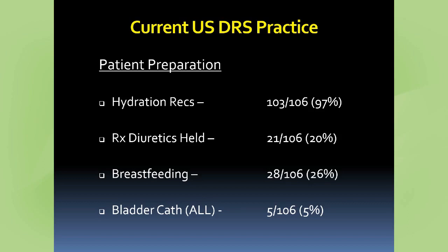And that used to be the standard of care. But now it's really, like I mentioned, very young patients, neonates who can't void spontaneously, we catheterize them. Anybody else with difficulty voiding. And then the other time we consider it is if it's specifically requested by the urologist. We certainly want them to trust the results. So we'll let the patient know that their physician has requested that.